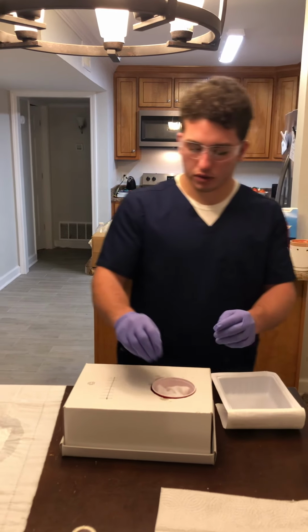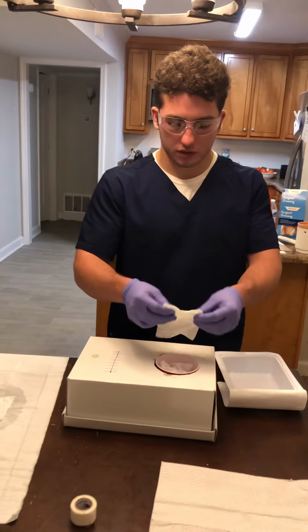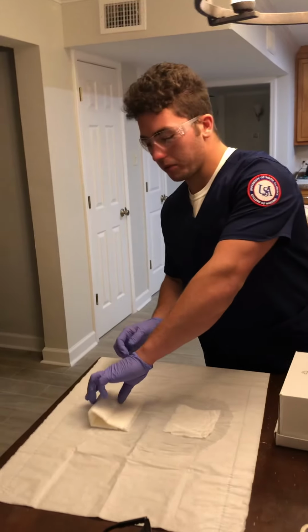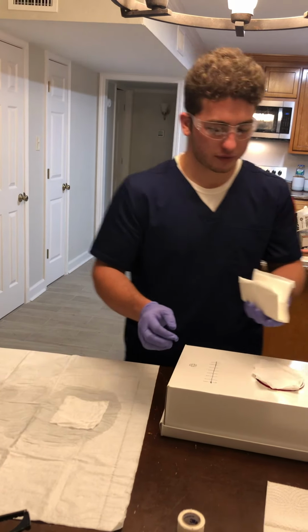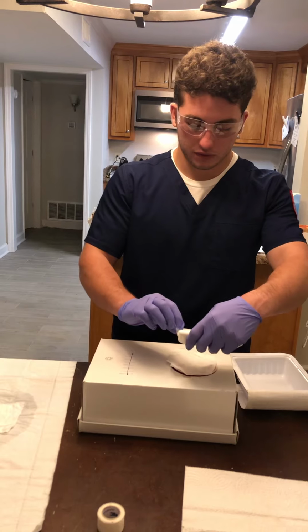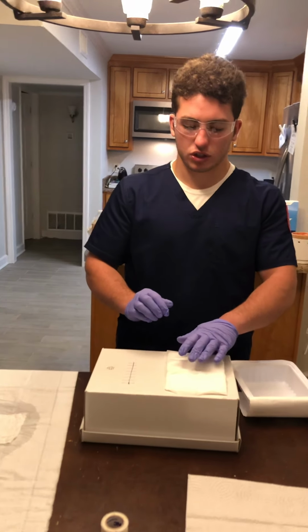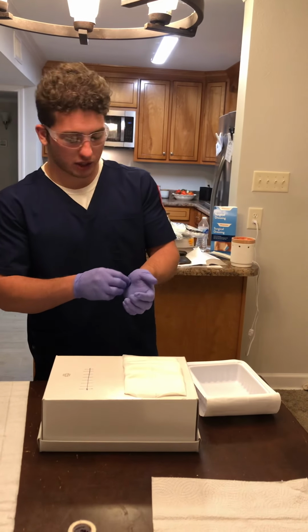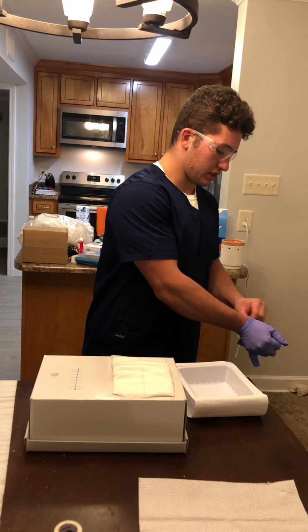I'm now going to cover with a piece of dry 4x4 gauze. And then take my abdominal dressing, grabbing from the outside, ensuring not to touch the inside with my gloved hand. Lay it as such. Now I will dispose of my sterile gloves, glove to glove, then skin to skin.